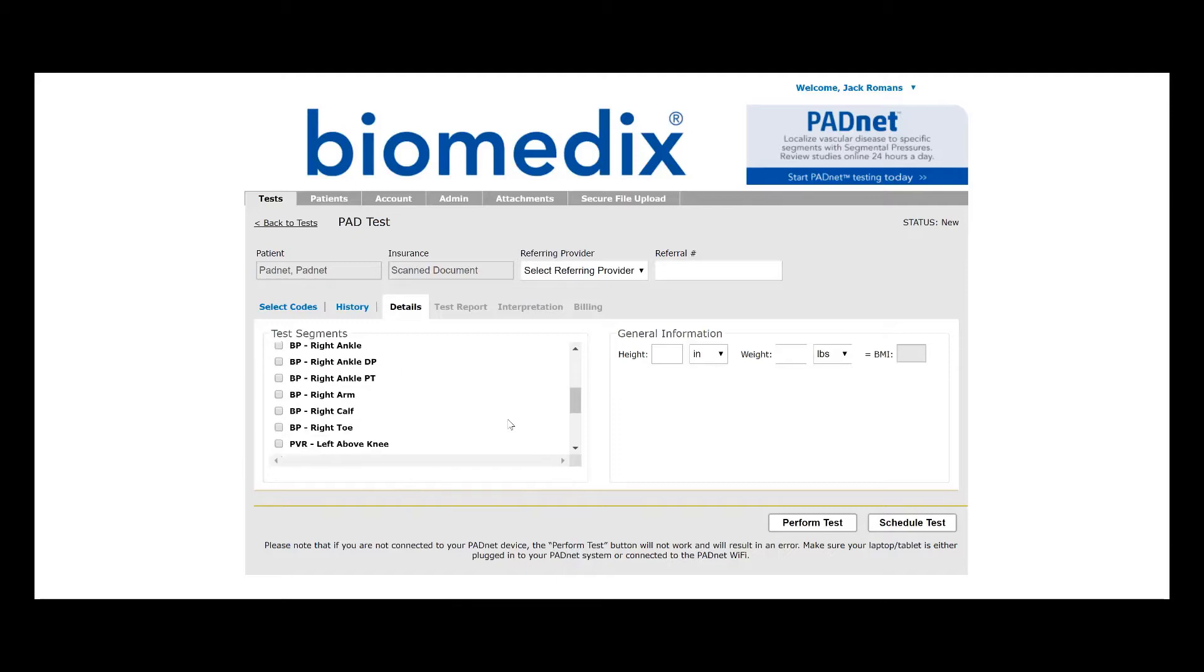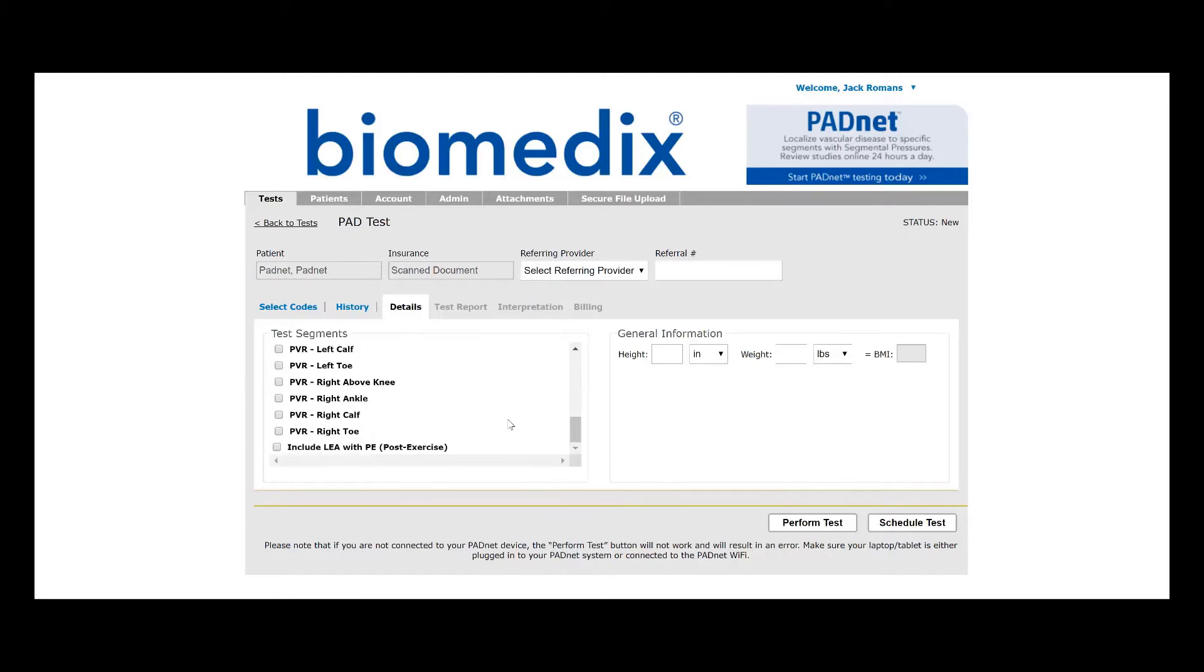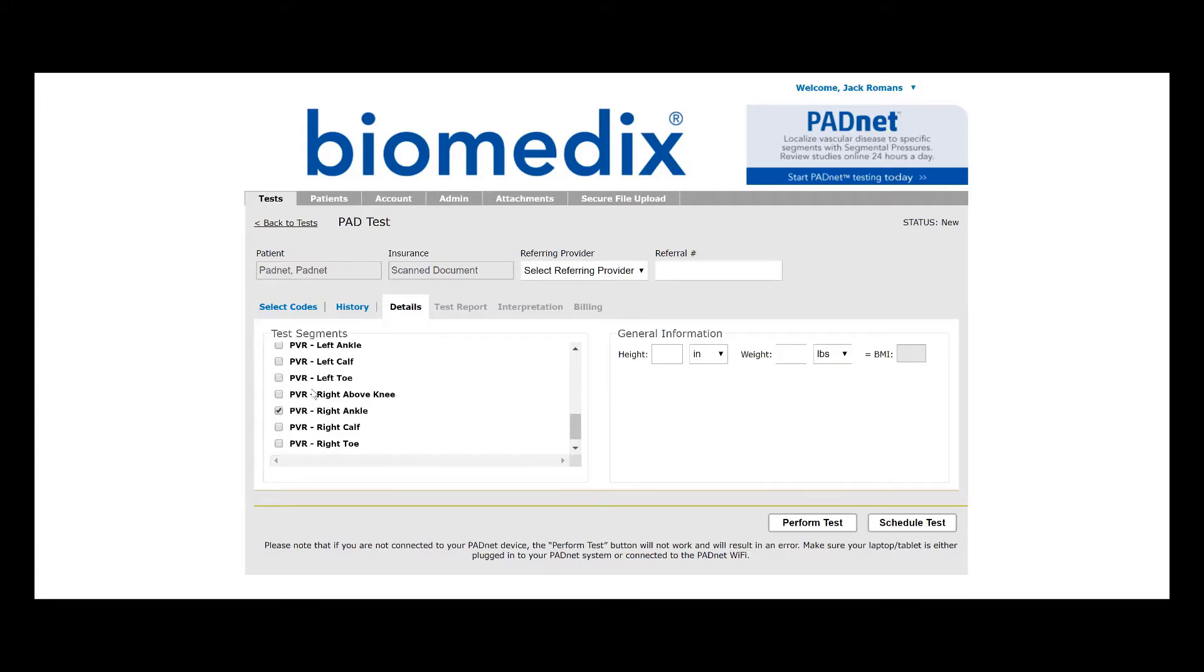Now, you'll notice here, because we selected Screening in the Procedure Code, none of our test segments are selected, so we're going to select PVR in the right ankle and the left ankle.